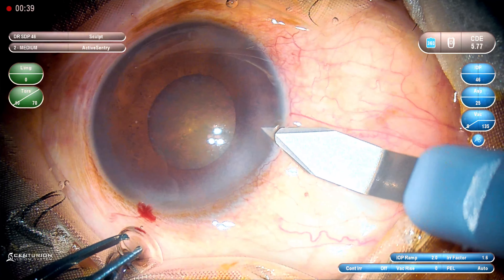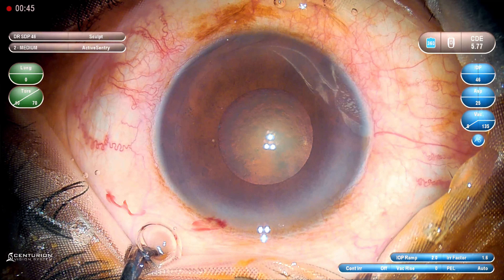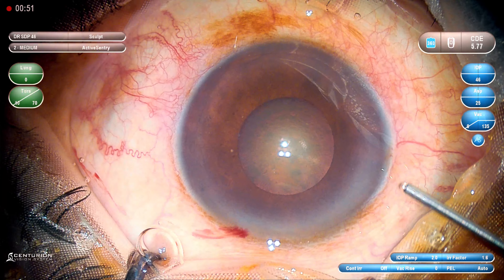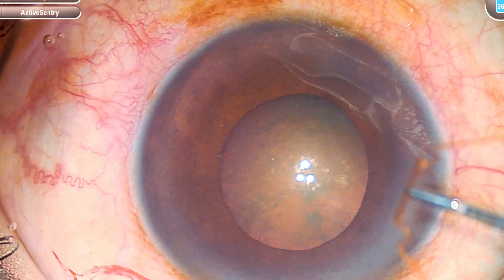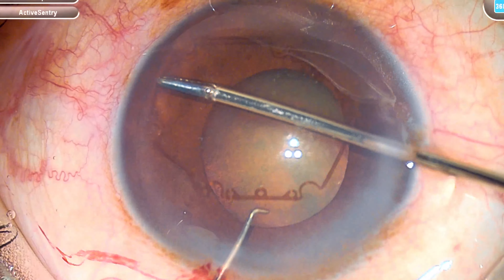The anterior chamber is a little bit on the shallower side. While making the main incision, make sure that you have adequate length into the cornea so as to avoid any iris prolapse. You don't want a premature entry. The viscoelastic used here is Hilucote, which is a heavy dispersive viscoelastic. And I am going to use the B-hex pupil expansion device.